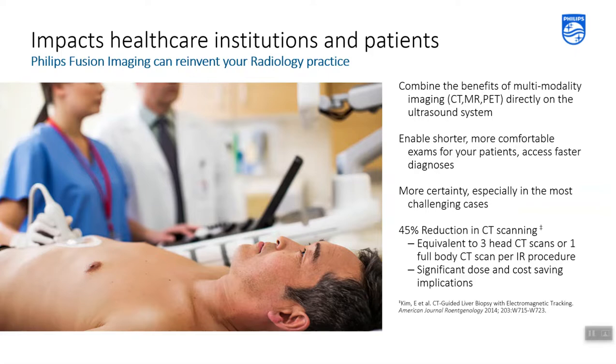When we are looking at liver lesions, this can be very helpful to capture the arterial phase, because the arterial phase will start at around 10 seconds after the contrast injection. And if you know the exact location of the lesion, then you are able to capture the arterial phase, and this can help in more confident diagnosis.